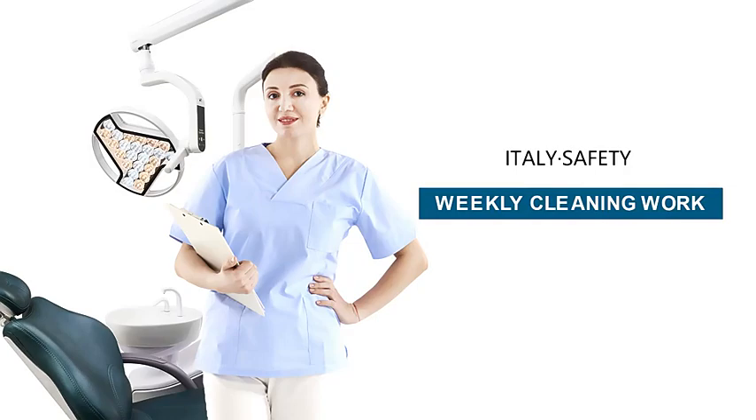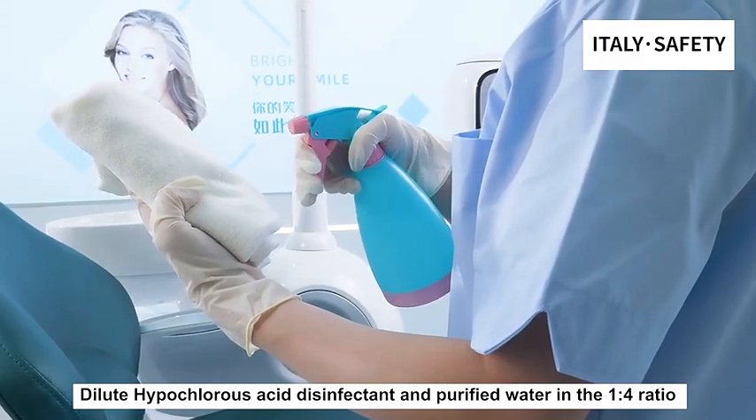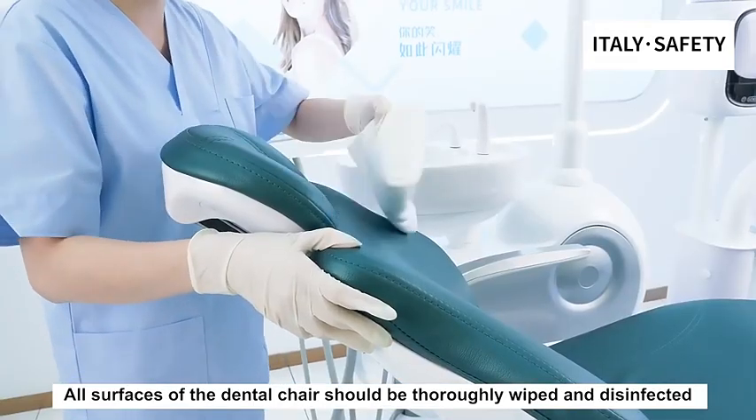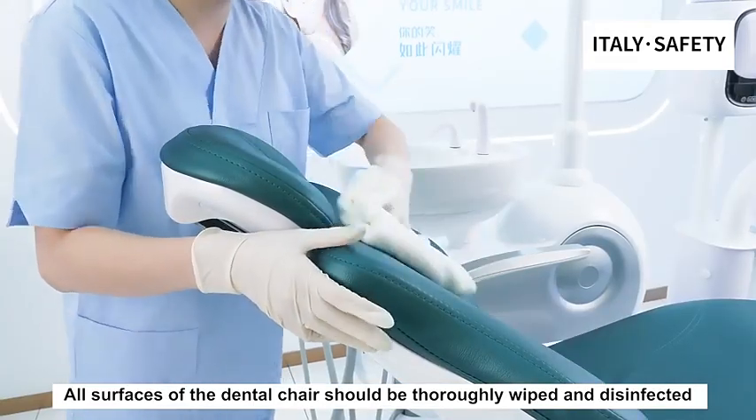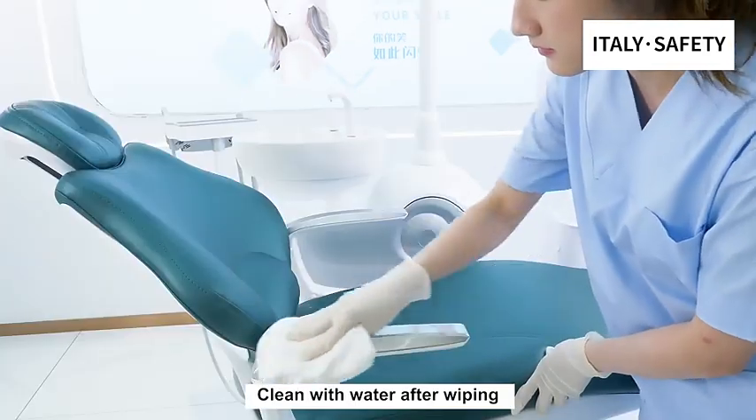Weekly Cleaning Work. Dilute hypochlorous acid disinfectant and purified water in a 1 to 4 ratio. All surfaces of the dental chair should be thoroughly wiped and disinfected. Clean with water after wiping.